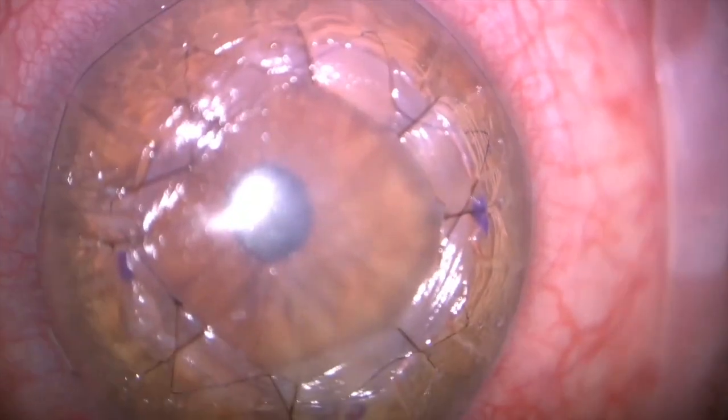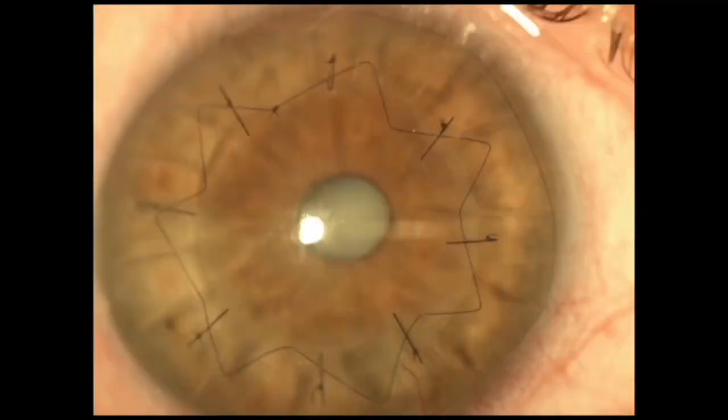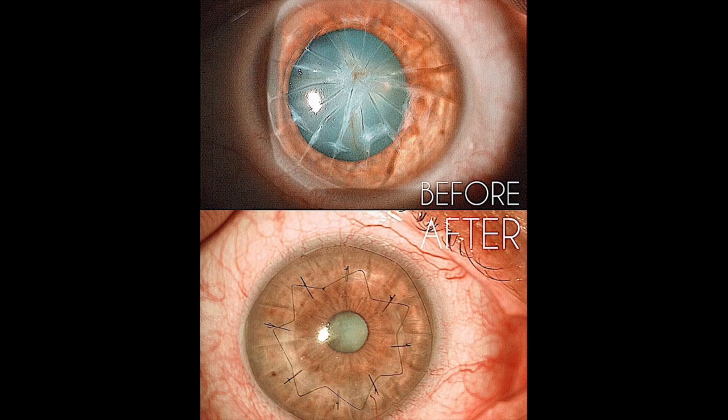My anti-torque suture — I usually love for it to look like a star — but this is asymmetric because of the way we had to come out in different areas. This is the pre and post, and thank you for your attention.